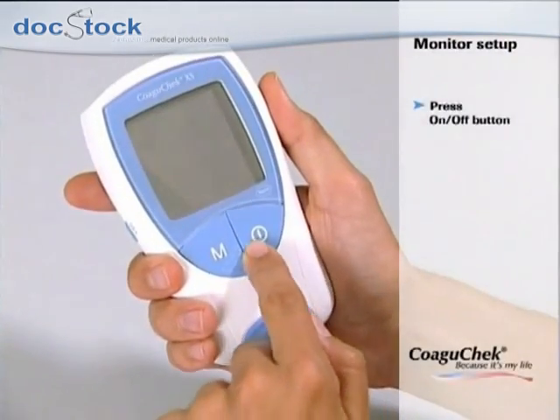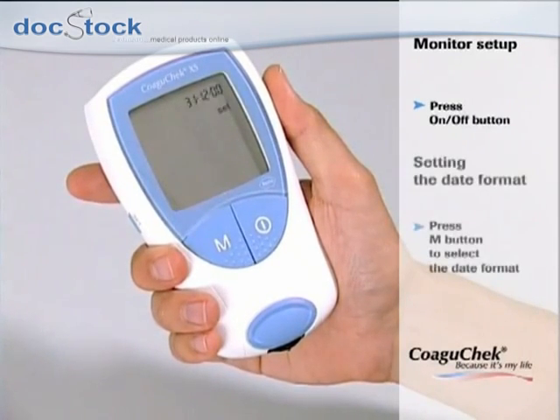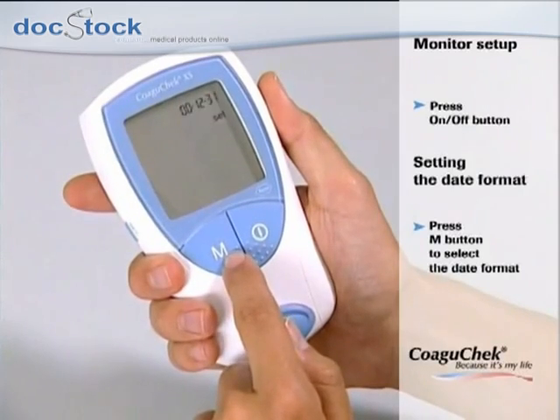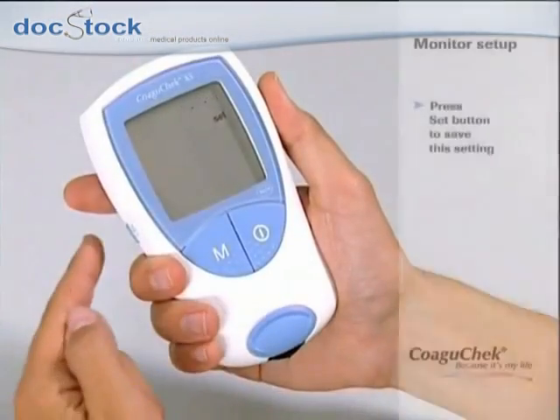Now you can turn on the monitor by pressing the on/off button to enter the setup mode. First, select the date format. Press the M button to select the desired date format, and save your setting by pressing the set button.